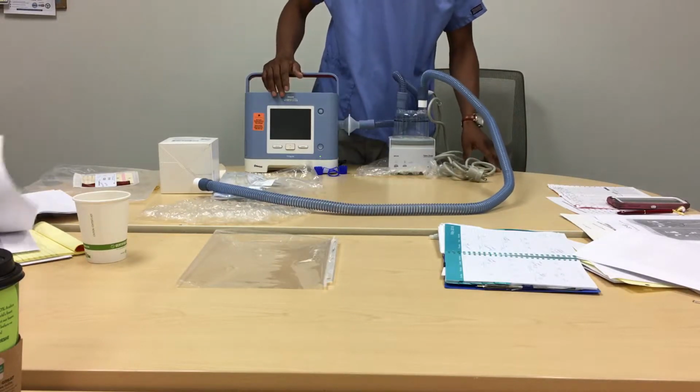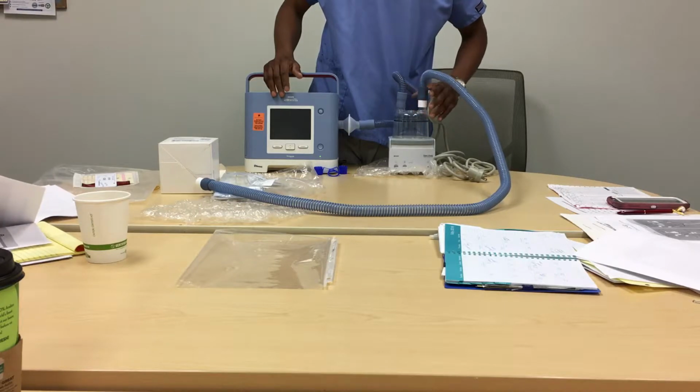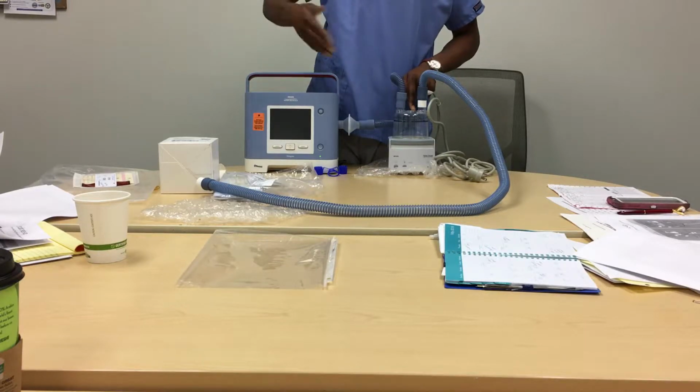Now, every week, I suggest they clean everything. If they are to change the base, the bottle, depending on what the insurance will pay for, they could change the bottle every month. If not, they just clean it out and change it as the insurance pays for it.